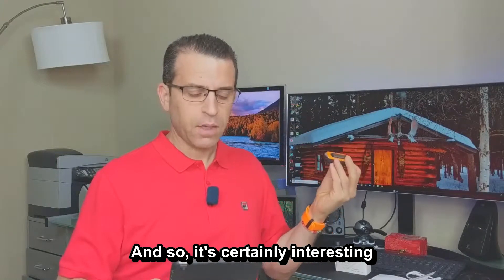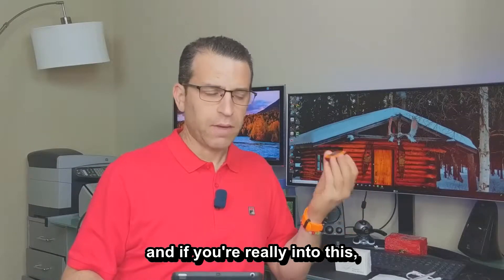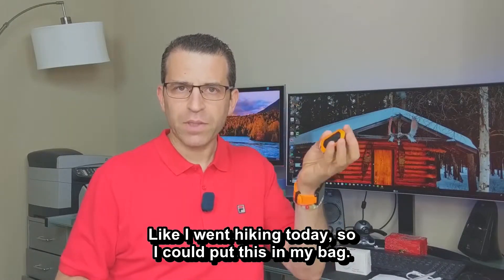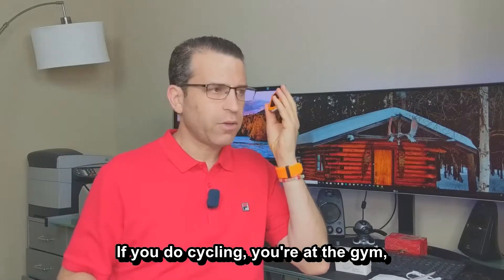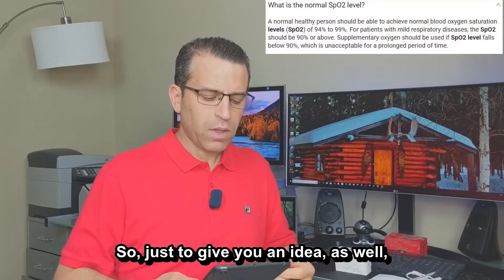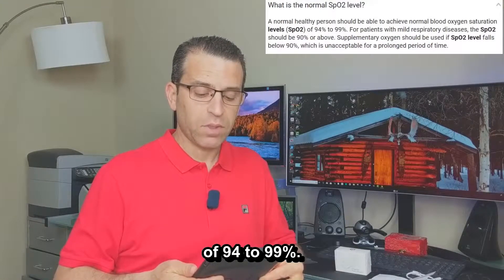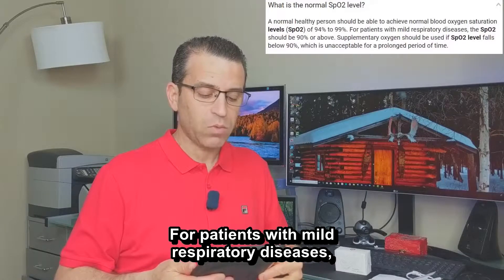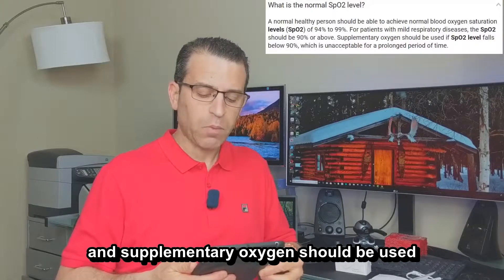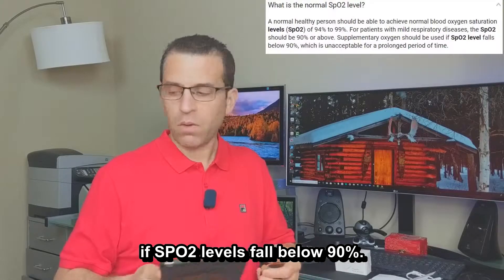It's certainly interesting to get a reading, and if you're really into this, it's a nice small device you can take with you. I went hiking today, so I could put this in my bag. If you do cycling, go to the gym, or anything physical and just want to know how your health is — a normal healthy person should achieve blood oxygen saturation levels of 94 to 99 percent. For patients with mild respiratory diseases, SPO2 should be 90 percent or above, and supplementary oxygen should be used if SPO2 falls below 90 percent.